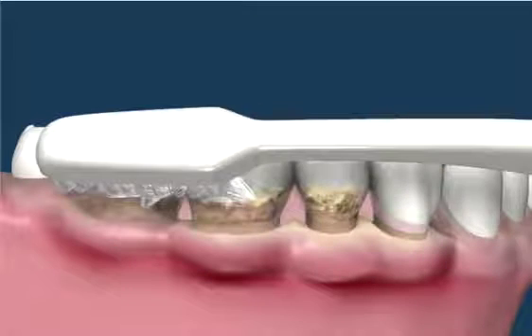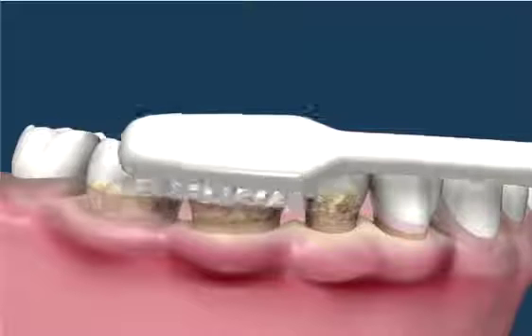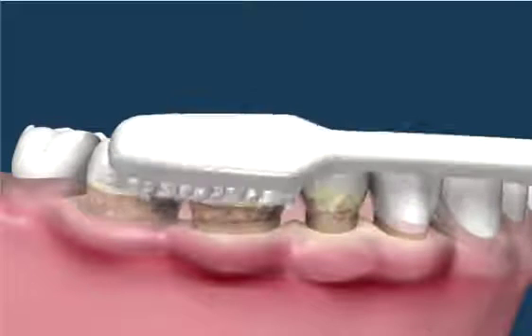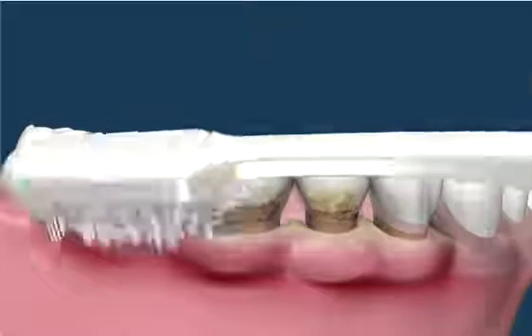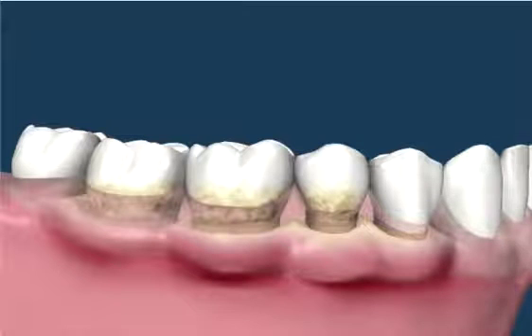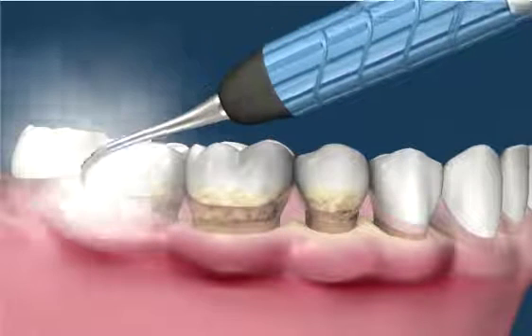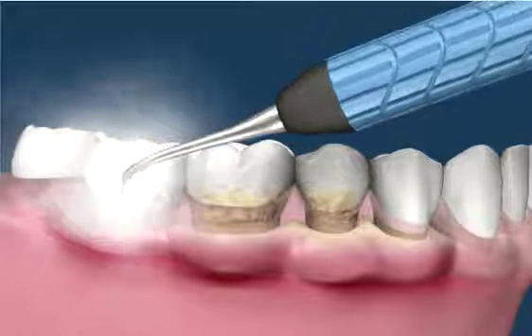Brushing with a toothbrush will remove the plaque, but will not remove the calculus as it is very hard — it is sometimes called dental stone. The dentist or hygienist can use ultrasonic instruments that vibrate together with a jet of water to dislodge the calculus from the teeth.